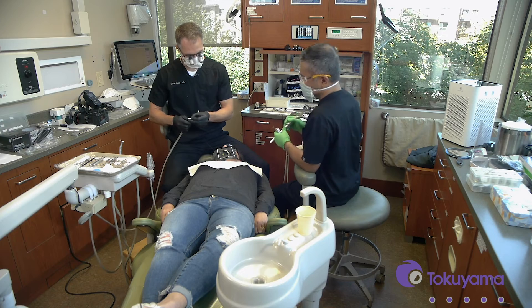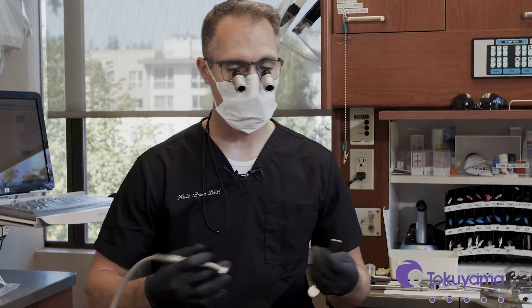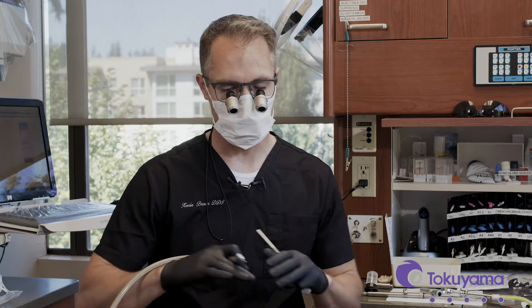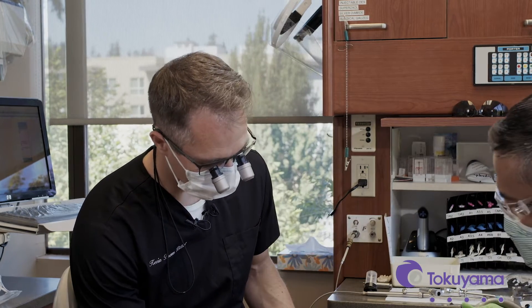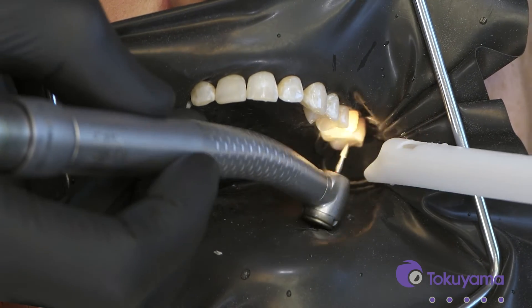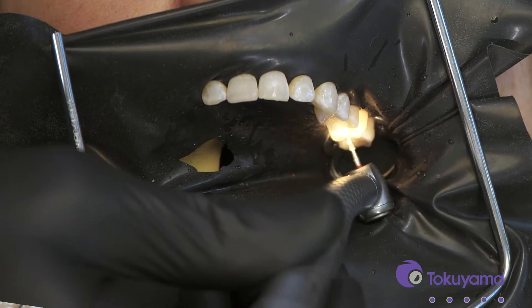When I do these restorations — not just with Omni Chroma but any composite, but especially with Omni Chroma when you're looking to get perfect color adaptation and have things disappear perfectly — I like to put just a small bevel on the occlusal surface margin of the restoration. That's going to allow better adaptation, a better seal, and help with the C-factor shrinkage that can happen. So let's use a real fine grit diamond to do that. It's just a very subtle, small bevel, almost imperceptible.